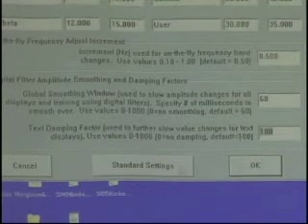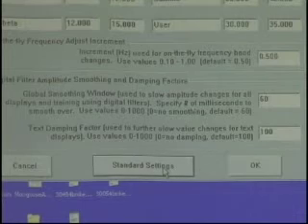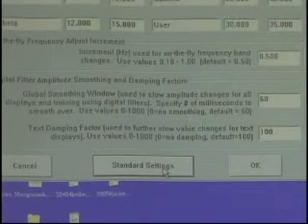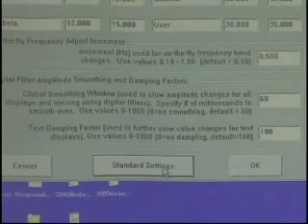If you make changes and want to get back to defaults, hit Standard Settings and it goes back to the original. Any questions on the screen? Pretty straightforward — not a lot going on, but it gives you the capability of adjusting these components.